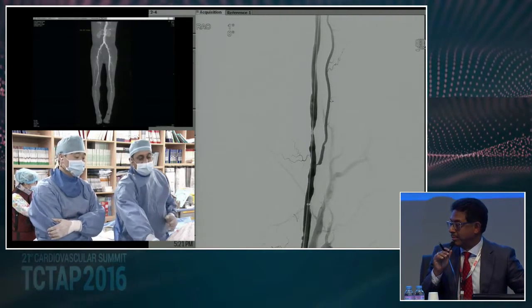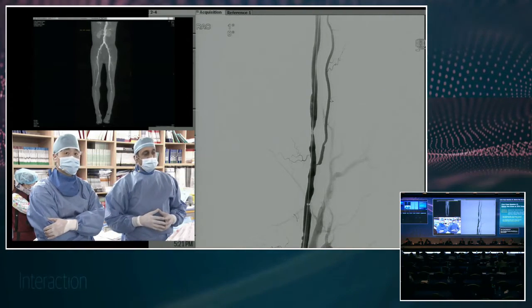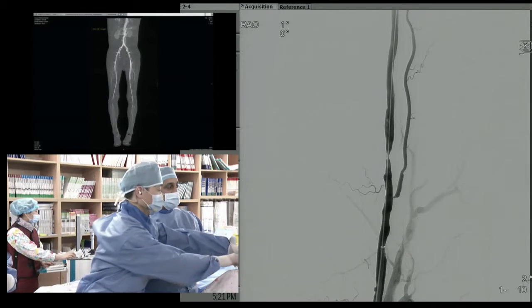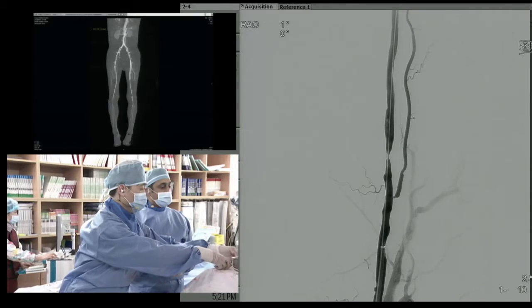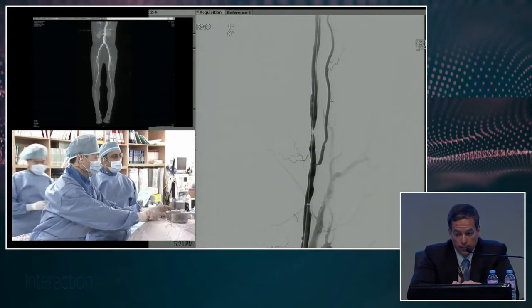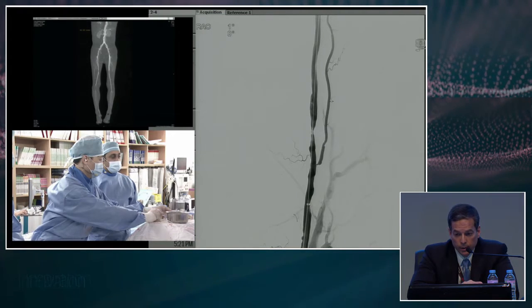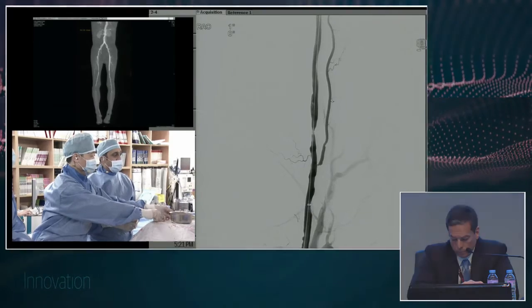It might. I'm surprised you didn't say atherectomy. POBA or DCB? Yeah, I guess the question is, what do you lose on this? I think that to Chris's point, if you just do a balloon and see what it looks like, I don't know that you gain a lot with the DCB for this short a segment, but I think it wouldn't hurt. I just don't think that it will clearly make a big difference for you. Okay, great. Anybody advocate for atherectomy here or stent here?